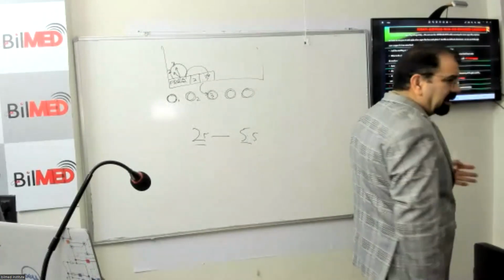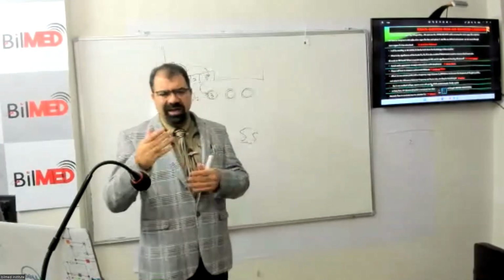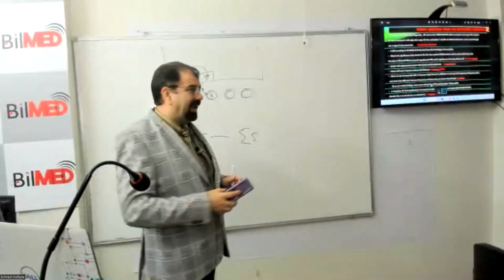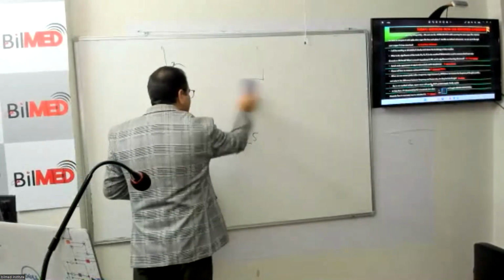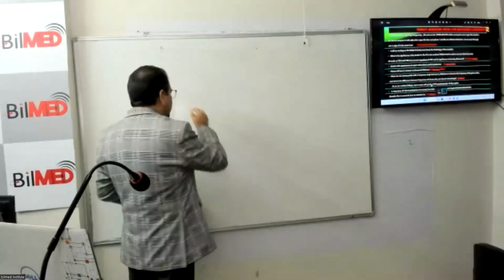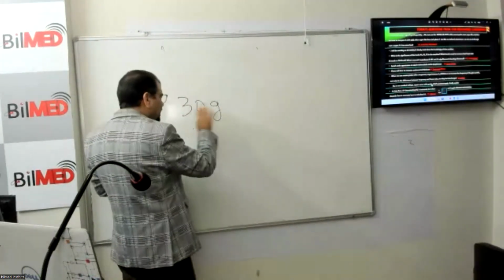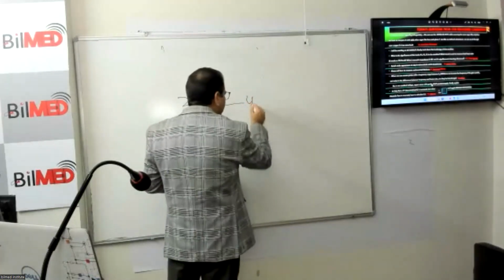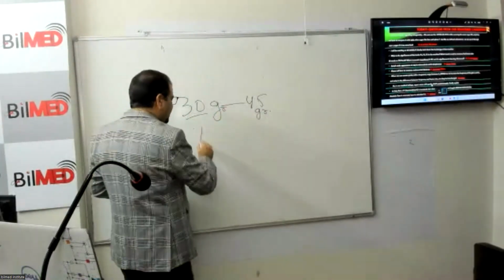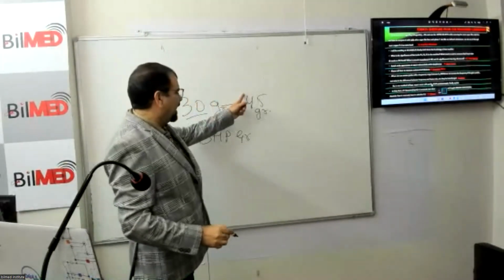Now Dr. Abhinash, prostatomegaly. Now see, the question is whether I should use grade 1, grade 2, grade 3. Preferably no. When I say prostatomegaly grade 1, it is about 30 grams. Now this is age dependent, roughly 30 to 45, age dependent. If I use BPH grade 1, grade 1 can be 31, grade 1 can be 44 also.